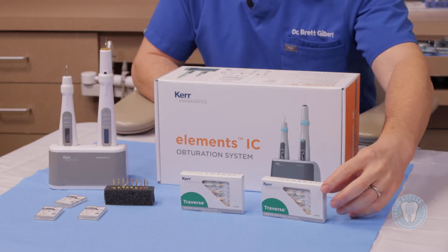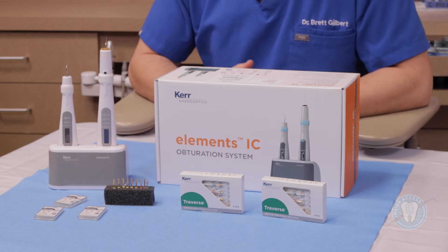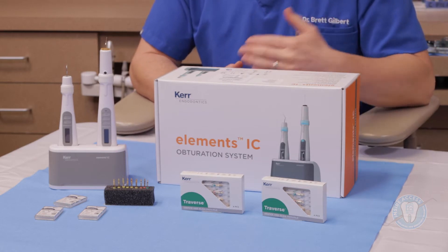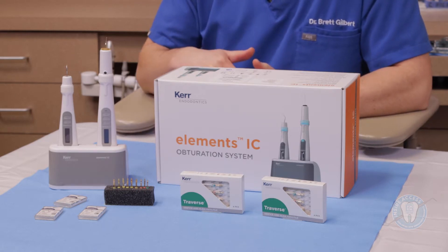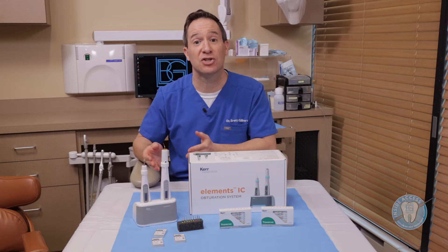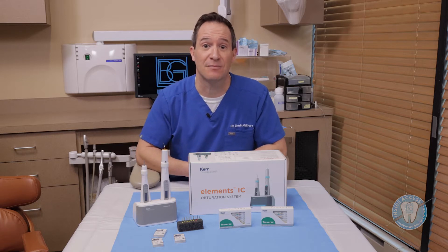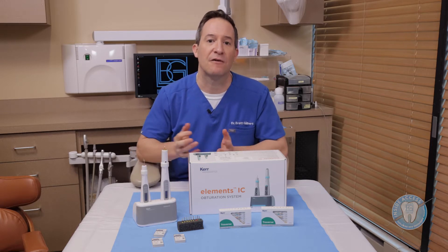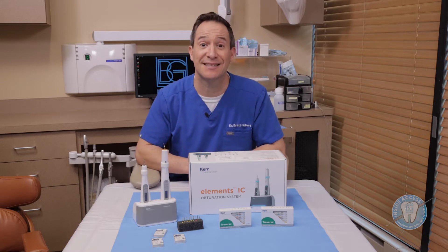The first is the Traverse system. Traverse is a glide path system — in essence a coronal orifice shaper as well as a very flexible glide path file. This starts your canal preparation, which can then be carried through in conjunction with the Zenflex system. Zenflex is a new file system just recently released on the market, and this allows you to finish off your root canal preparation. It's a very versatile system with multiple sizes and tapers.